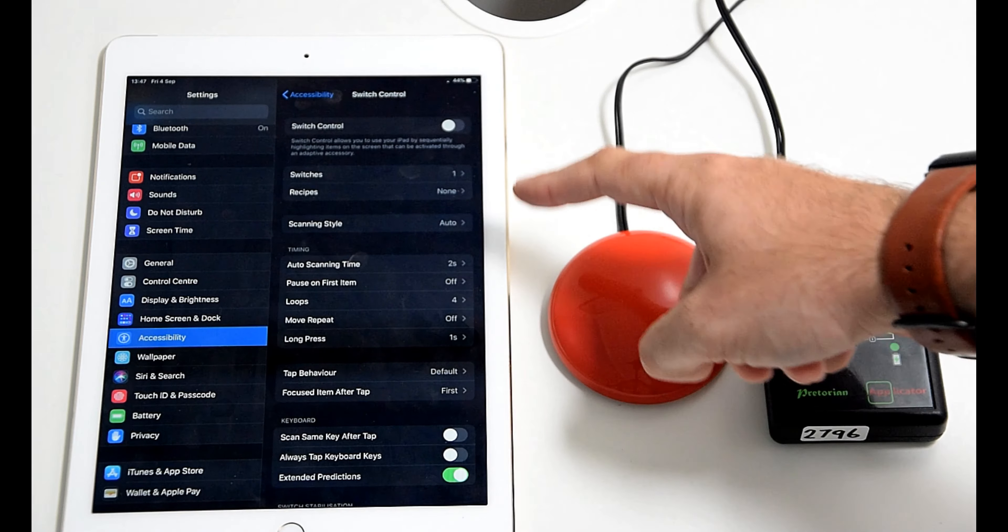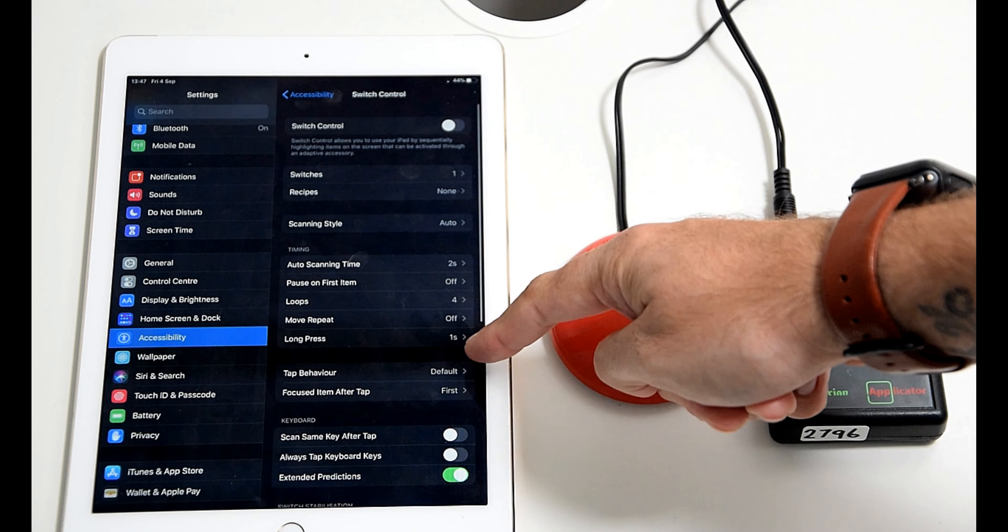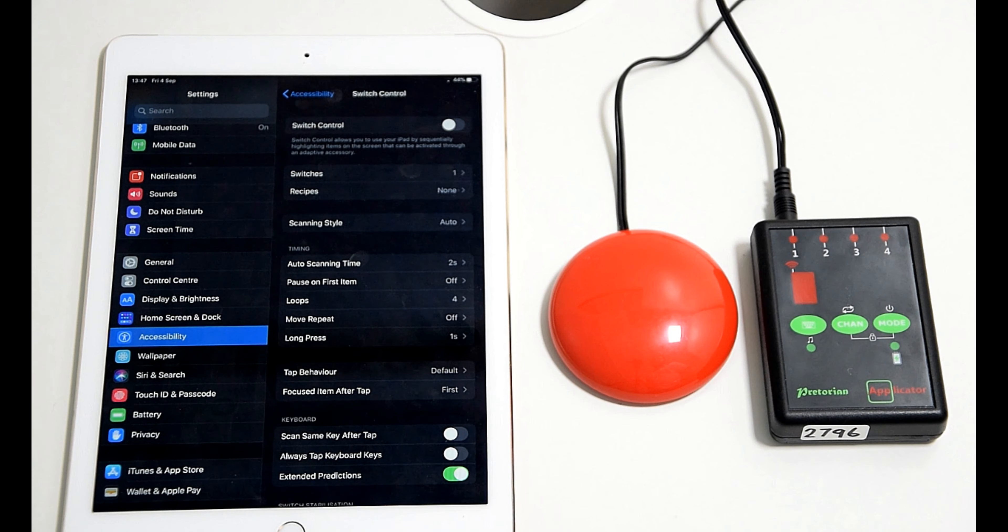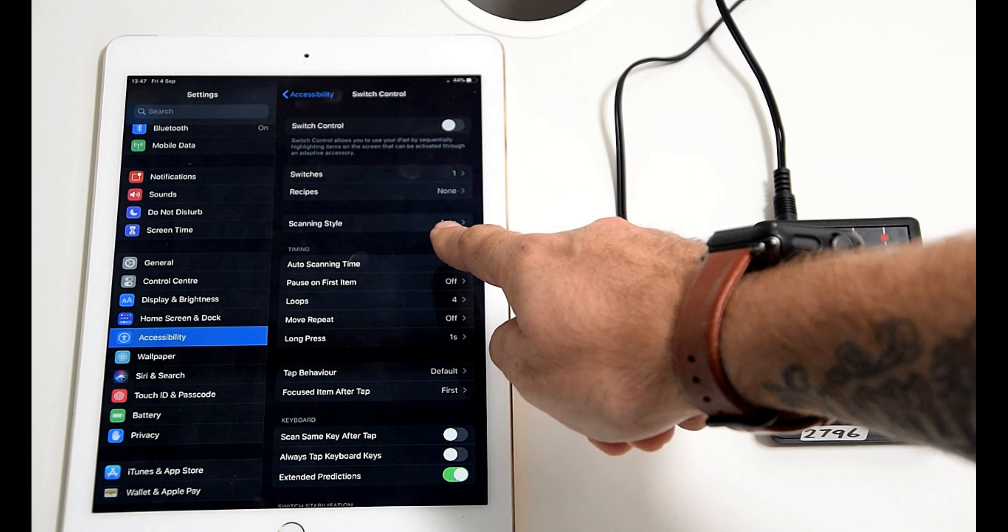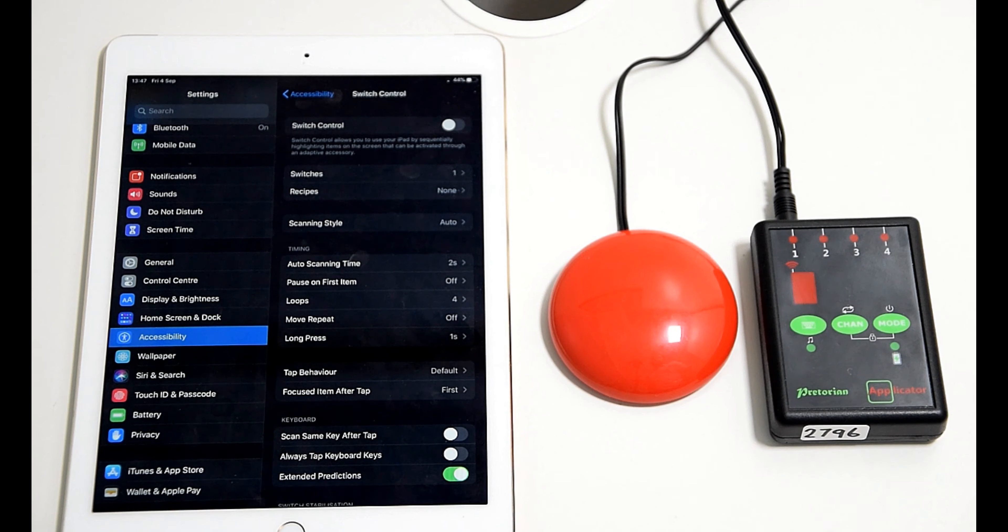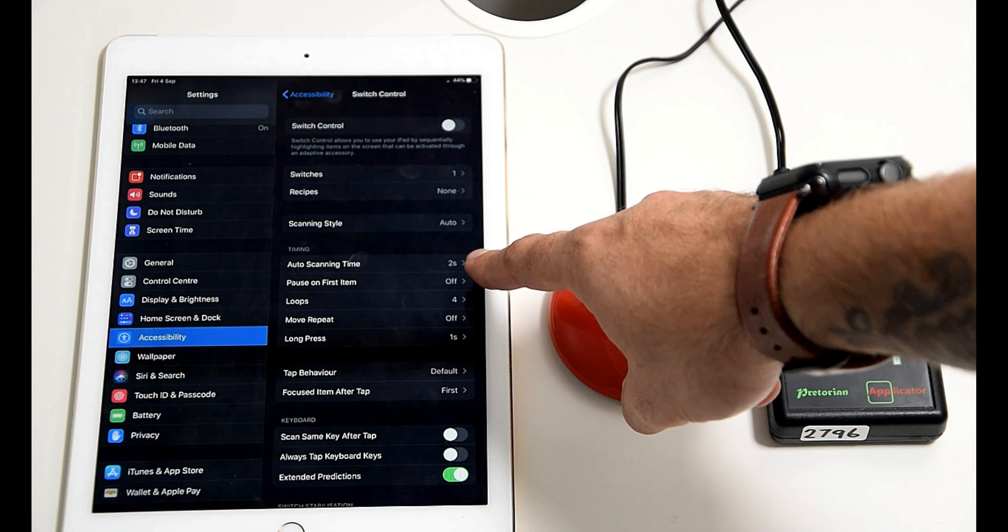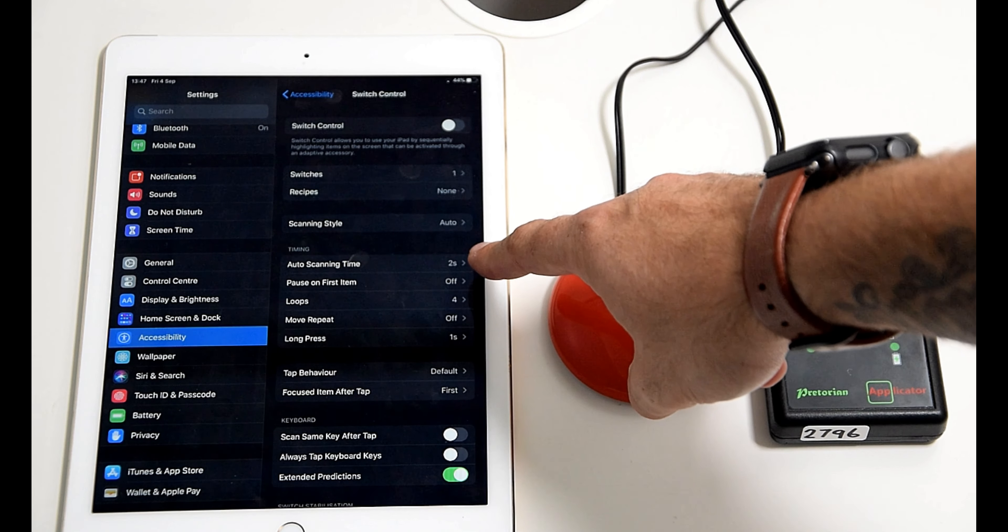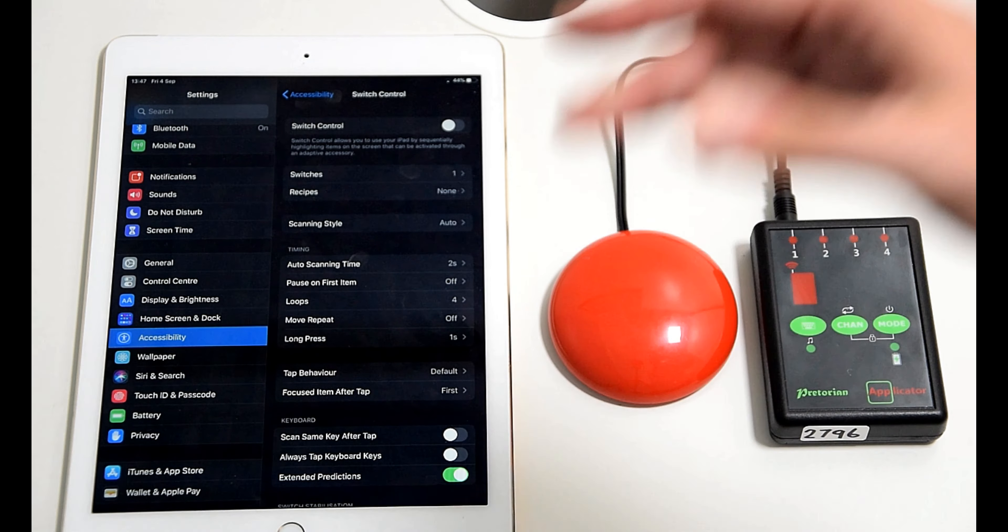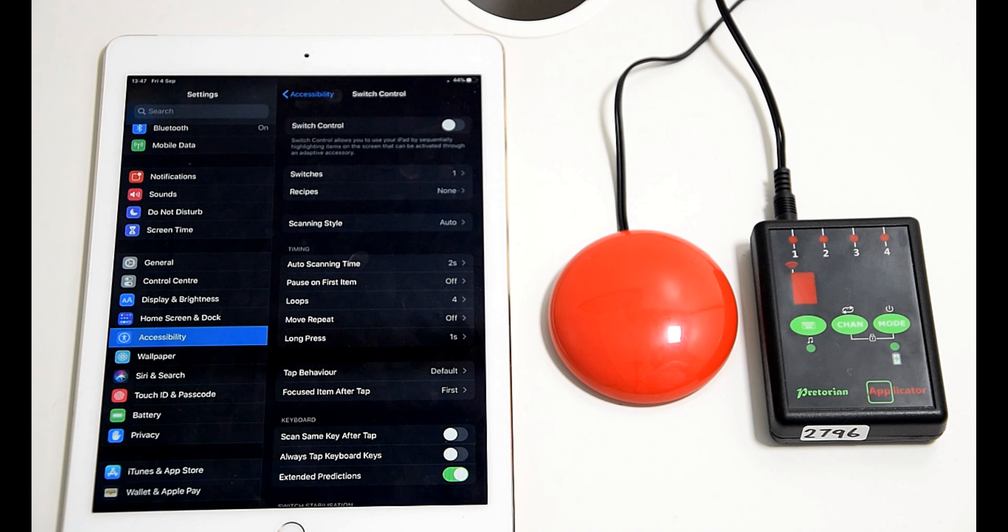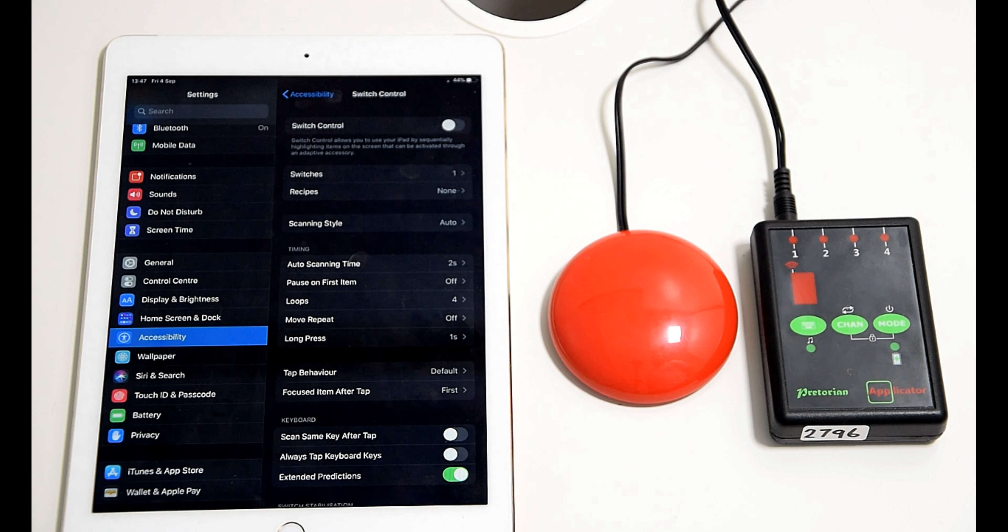When you come back out to this menu, it's worth noting you've got the timing menu there that appears when you're in auto scanning. So we've selected auto scanning there and it's automatically on two seconds, but you can change the amount of time it scans between each section when you are selecting within that blue box.